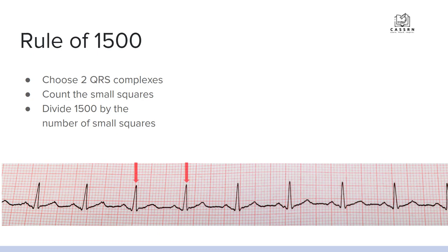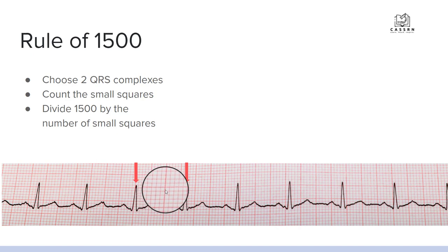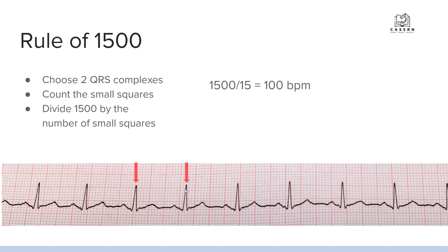We choose the same two QRS complexes used previously and count all the small squares between them: 1, 2, 3, 4, 5, 6, 7, 8, 9, 10, 11, 12, 13, 14, 15 — with about half a square at the edge, we'll call it 15. So 1500 divided by 15 equals 100 beats per minute. You can see this matches the rule of 300 result, confirming both are accurate here.